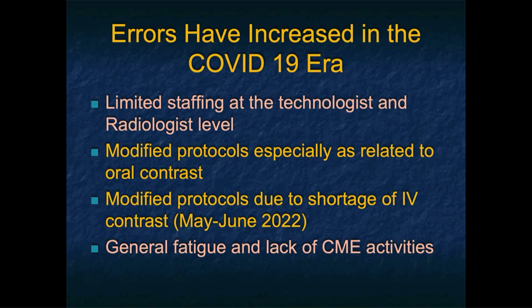I think one of the challenges across all of imaging in this post-COVID era is limited staffing, the challenges of technologists, the fact we modified protocols. I mentioned oral contrast before, and there was a shortage of IV contrast, general fatigue, overwork, and the like. That kind of puts things into a challenge: how do we do things well?